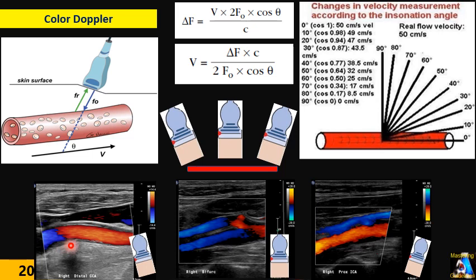On this spot, it starts changing direction. At the changing of the direction, as you can see, the angle between the blood flow and sound wave increases, and at some specific spot becomes 90 degrees, so it becomes black. This black line means Doppler shift is zero, so it shows black at the baseline zero. Then from that part onward, the direction changes and becomes away from the transducer, or the same direction as the sound wave, and it shows us negative shift, which is blue.